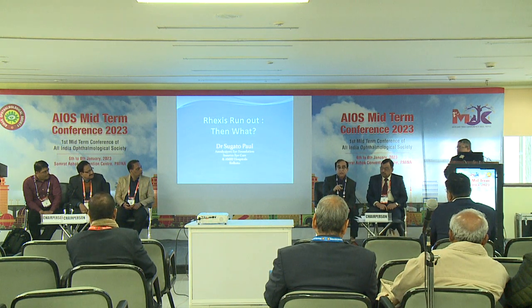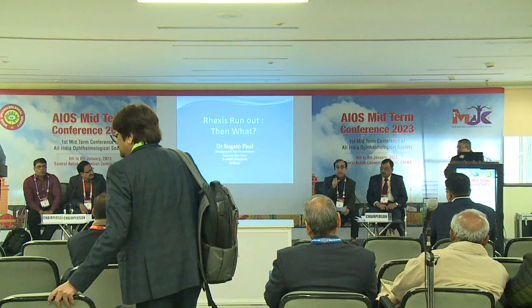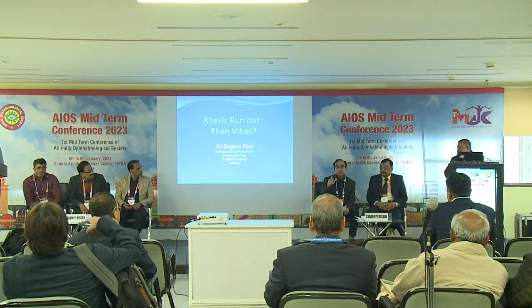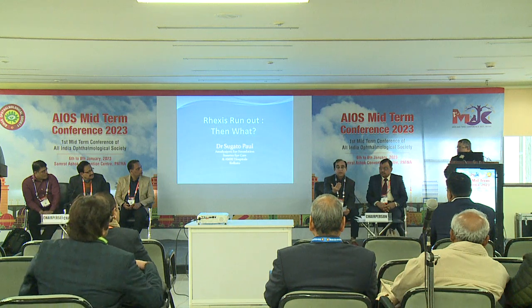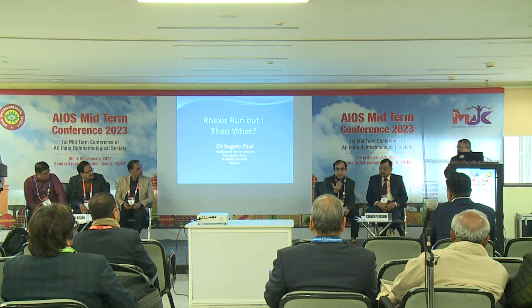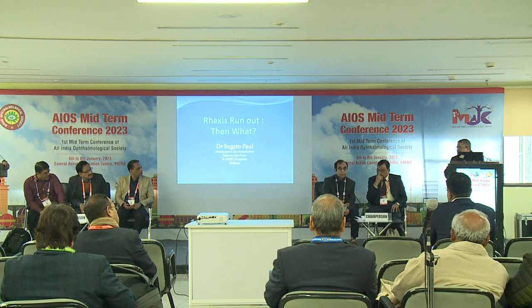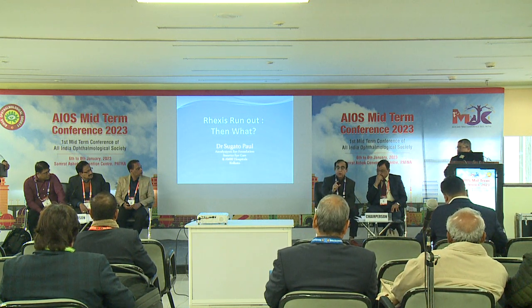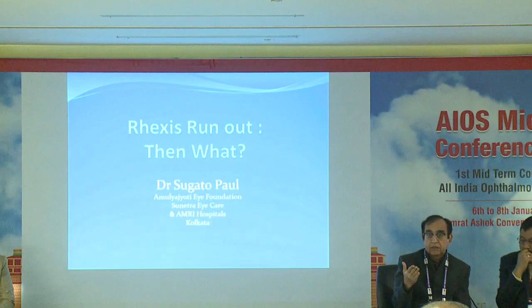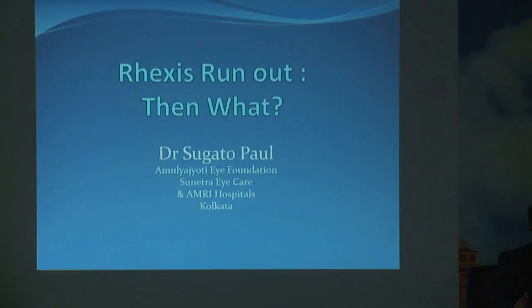So either the first minus, but of course this will vary in cases where you are using a multifocal IOL. When you are using a high power multifocal IOL, that means Synergy IOL, which has got a reading distance of say 33 centimeter, we do not want these patients to become myopic. Because if they become myopic, the reading distance will become 20 centimeter, 25 centimeter, which may be very uncomfortable. But if they are slightly hyperopic, it is okay if they read at 40 centimeter. And the size of the halos and glare also becomes larger if they are myopic. So if you are using the multifocal IOL, which gives good vision at 33 centimeter, then either emmetropic or the first hyperopic you should use instead of myopic.